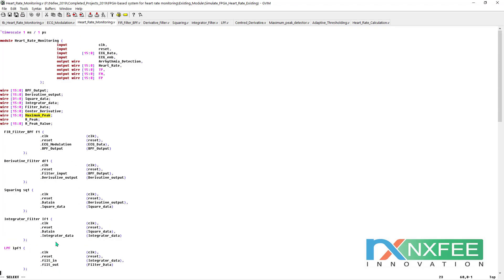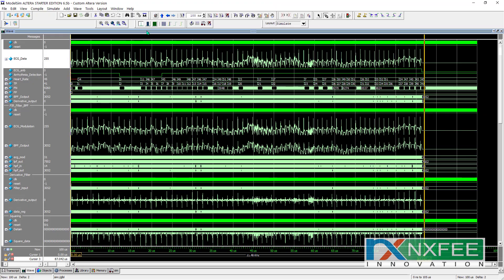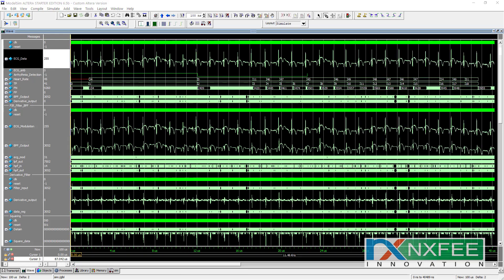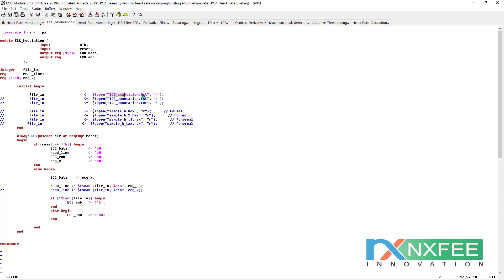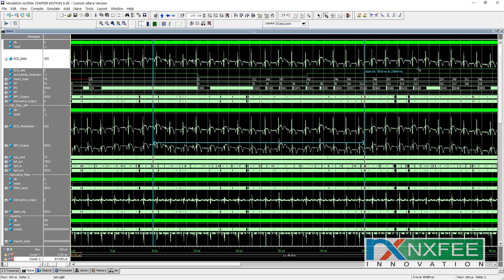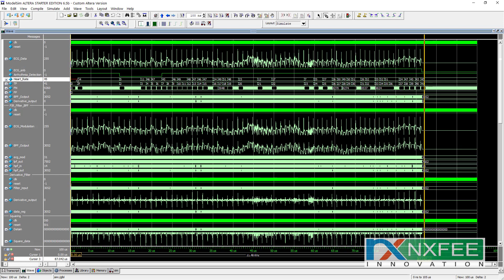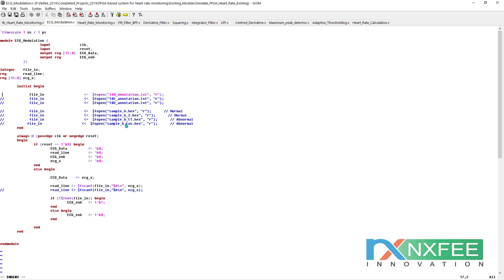This code was simulated in ModelSim software. The simulation was run using the 100 annotations data. As per the 100 annotations, the system calculates the heart rate value and detects arrhythmia. If the annotation input is changed to the hexadecimal normal value, the signal corresponds to a normal ECG.